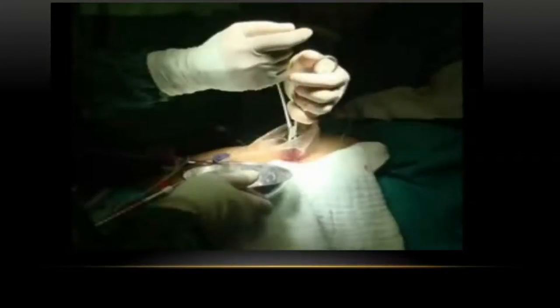So now the endo bag is taken out, the mouth of the endo bag will be exteriorized, and then with the ovum forceps you can pick it up, and the endo bag will act as a wound protector. And slowly, if you enlarge the incision a little bit, it can be taken out that way also, but better is to open the mouth and then take it out. So this way with the ovum forceps you will crush it and you will remove it.